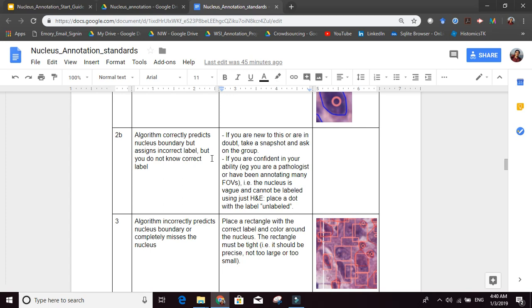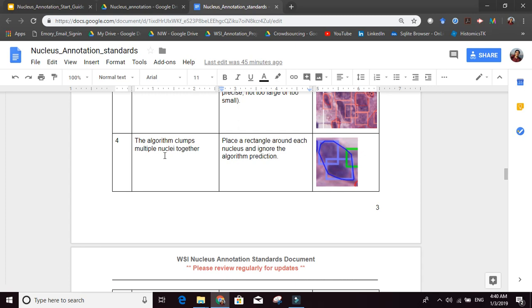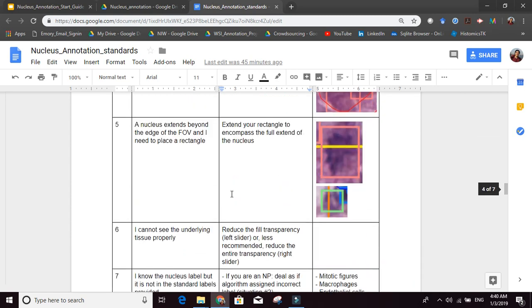If you're not new and you know what you're doing, then you can use the unlabeled label. We already talked about that. The algorithm incorrectly predicts the nucleus boundary or completely misses the nucleus, and this is where we said you would use the rectangle. The algorithm clumps together multiple nuclei. Again, you'd use the rectangle as if you don't even see what the algorithm said.